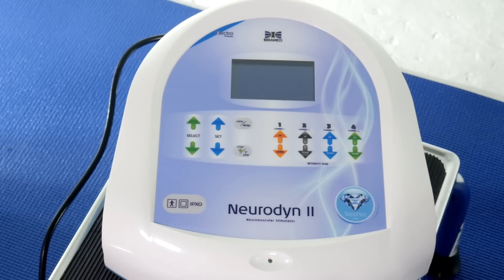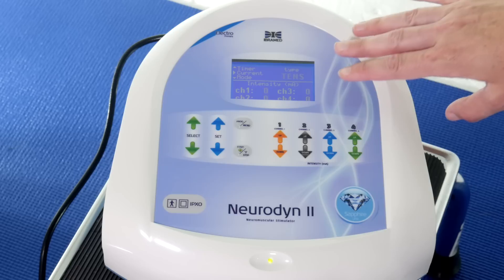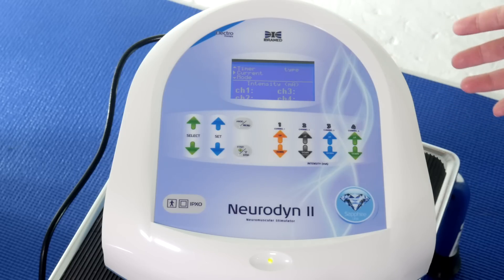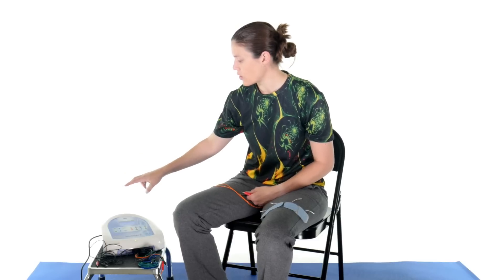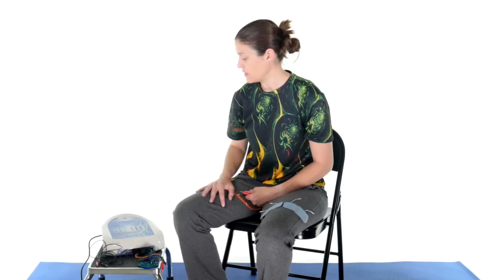When you turn it on, the IbraMed logo shows up and then it says Neurodyne 2. When you set up your parameters, it has all the options displayed here. I'm not going to go into too much detail about every parameter since this is designed for professional use — the clinician should know which settings work best for them and their patients depending on the injury — but I'll briefly go over the different selections, modes, and options available.